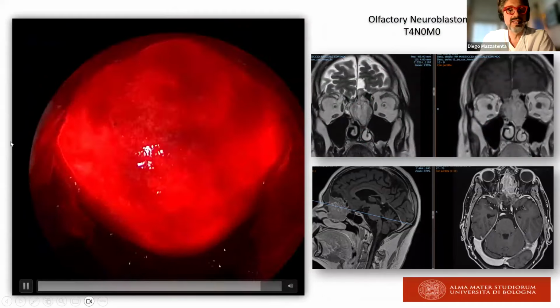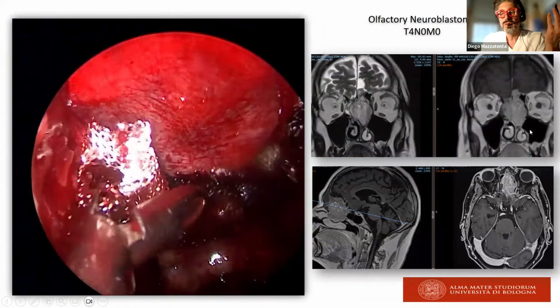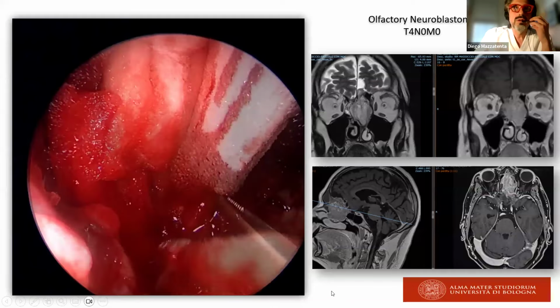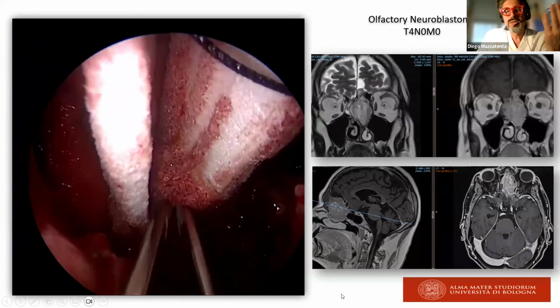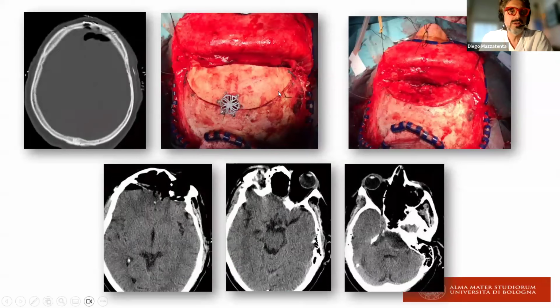We control transnasally the effectiveness of our closure, but in this case, there is no nasal tissue to control. So in this case, the surgeon is alone during this type of closure. In case the tumor permits use of the pedicle flap of nasal septum, we can also use the pedicle flap intranasally. This is the small frontal craniotomy. It's not enough to open widely. 2-3 centimeters is enough, no more, with only a burr hole, as you can see, to harvest the fascia, the galea, sorry.